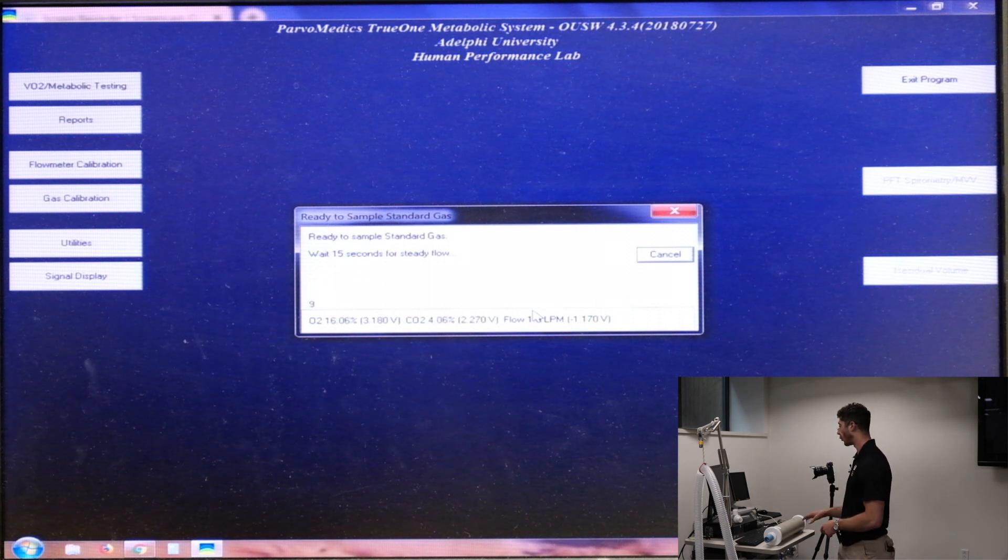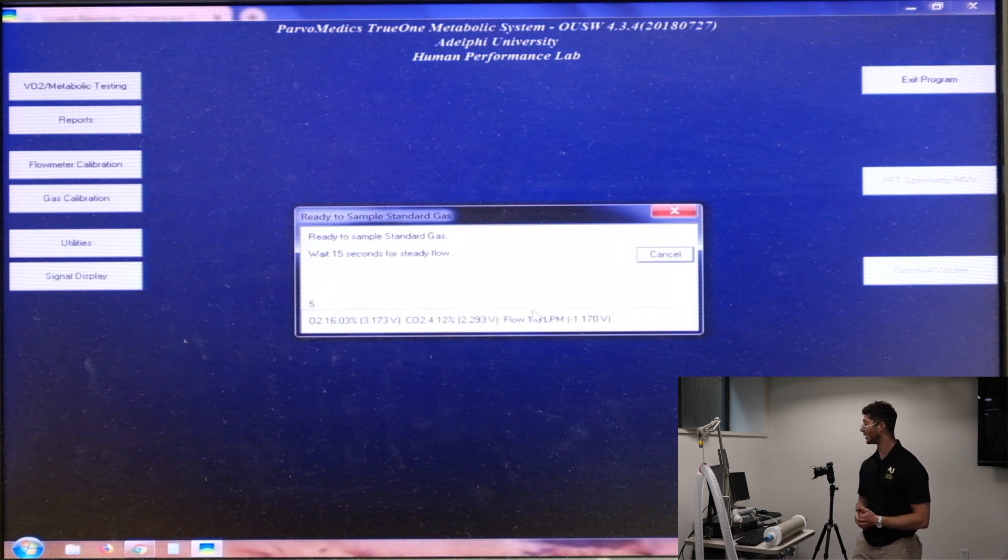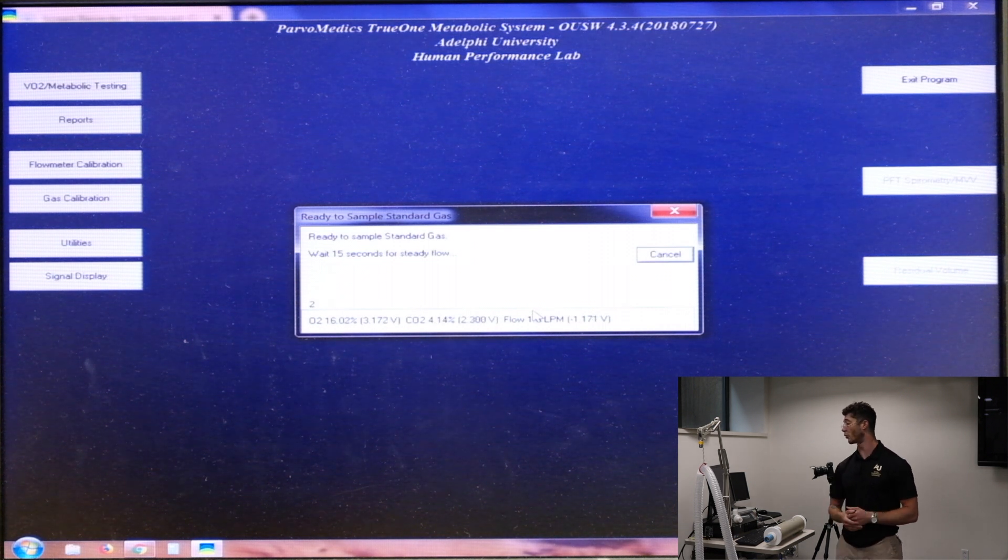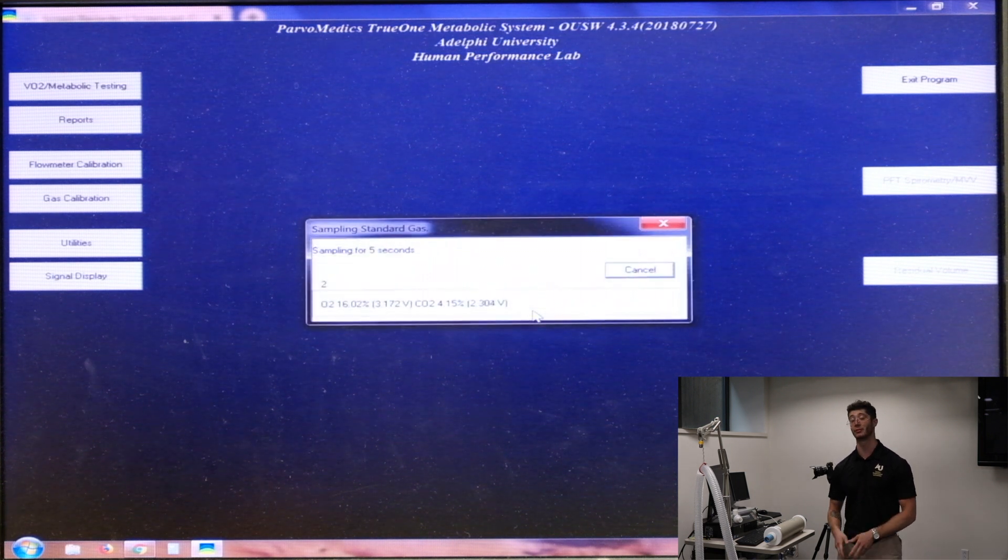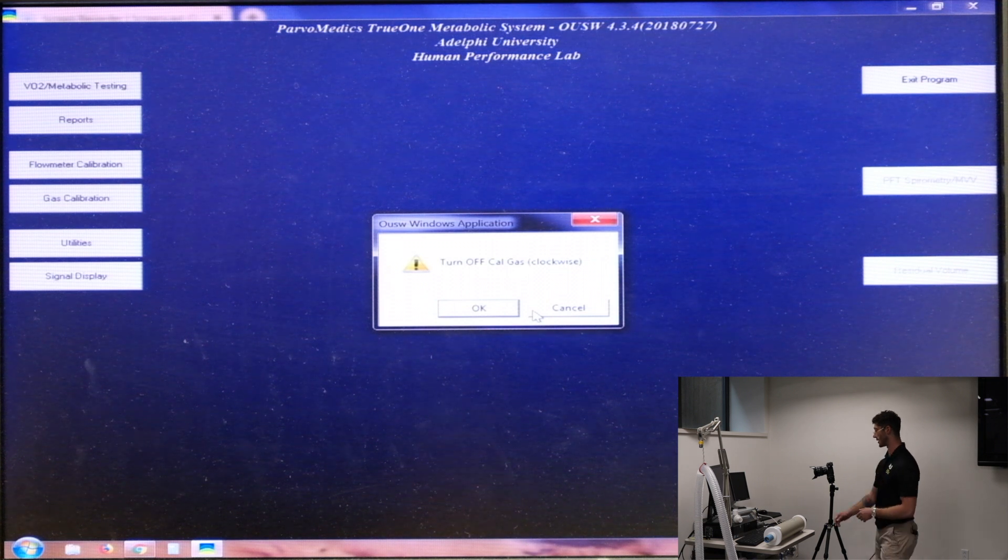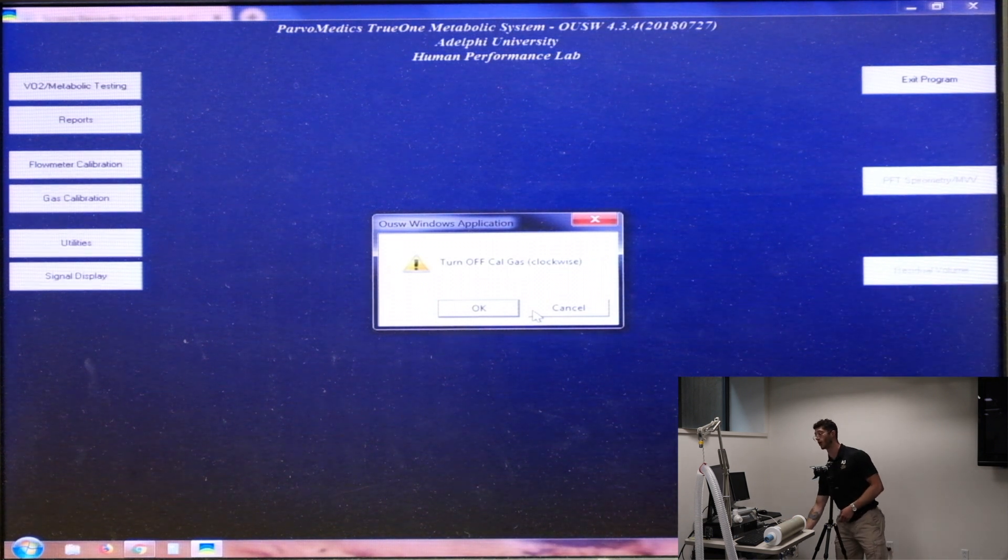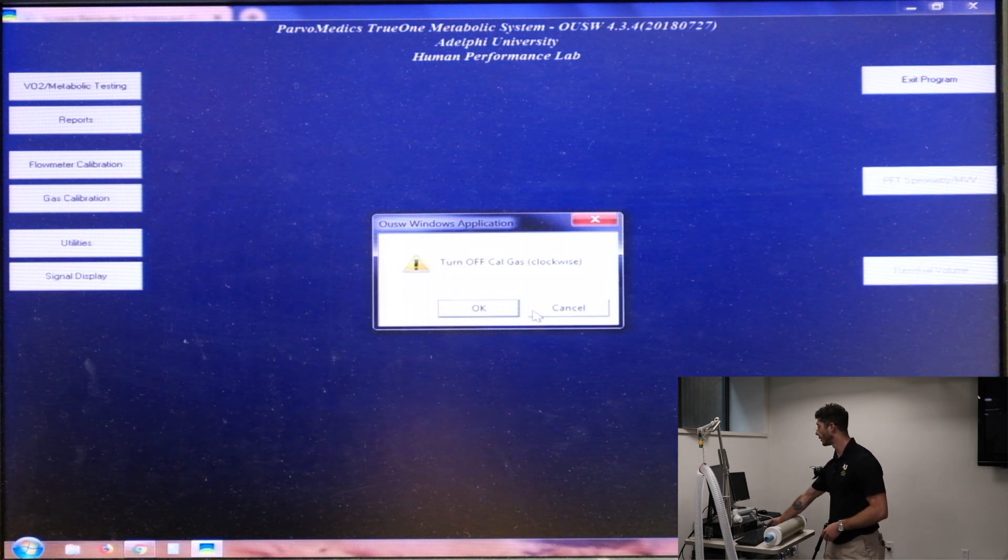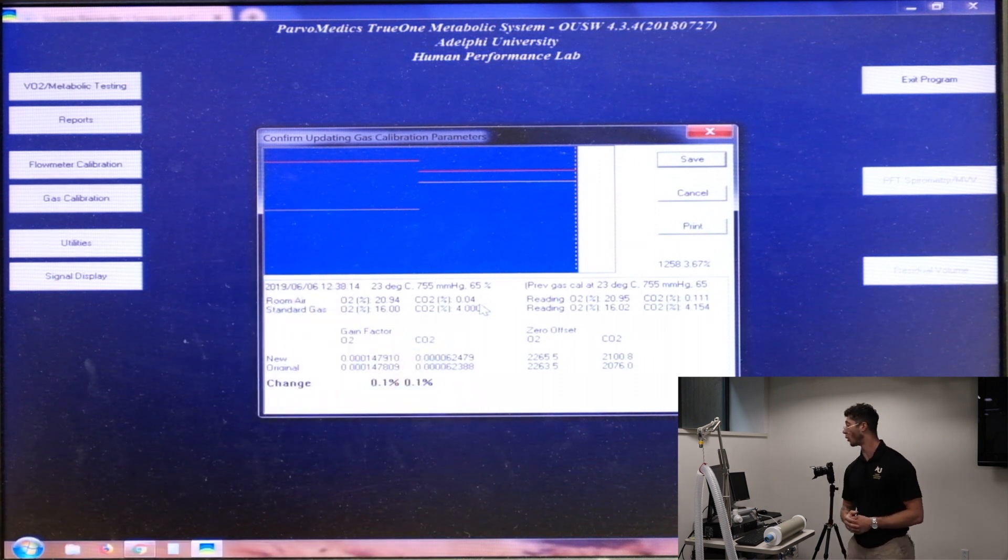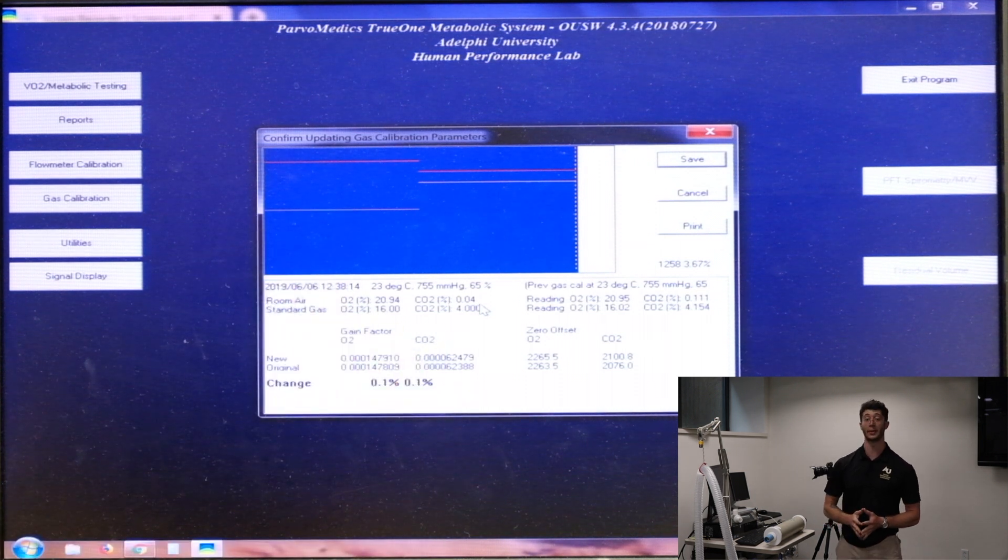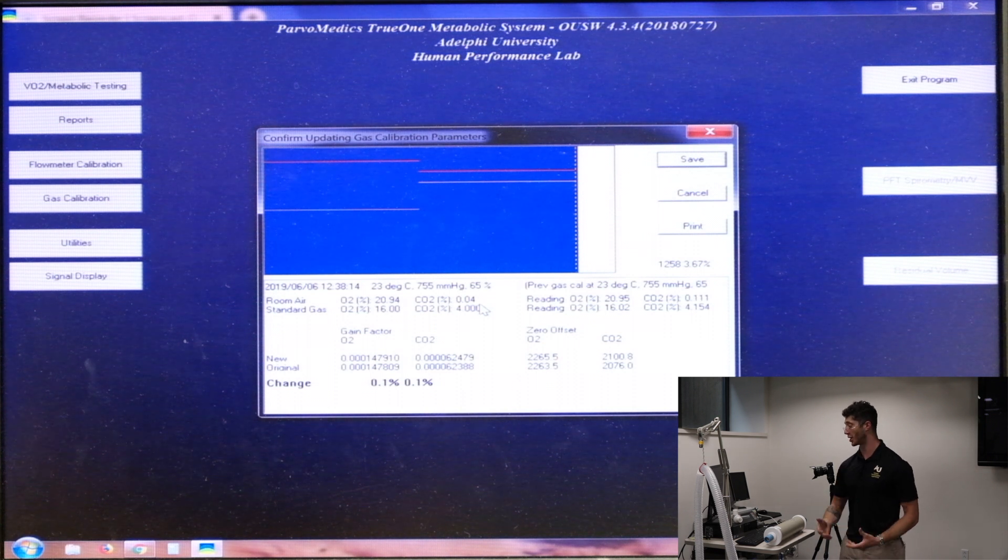Now we're looking at the standard gas and we're seeing that it is coming up at 16.02 and 4.14% for oxygen and carbon dioxide respectively. So you're going to see the correction factor in this next screen after I hit okay and I turn the gas cal off. So we'll click okay. And like I said, you can see there is a 0.1% correction factor for both oxygen and carbon dioxide, which means that there needed to be an adjustment.